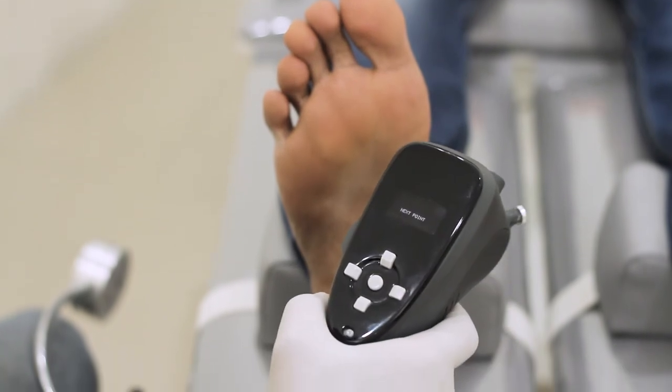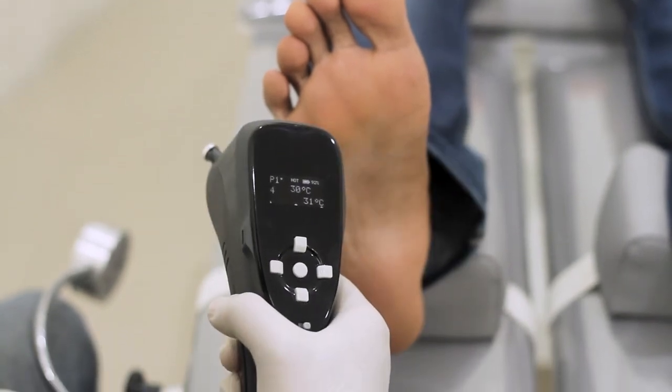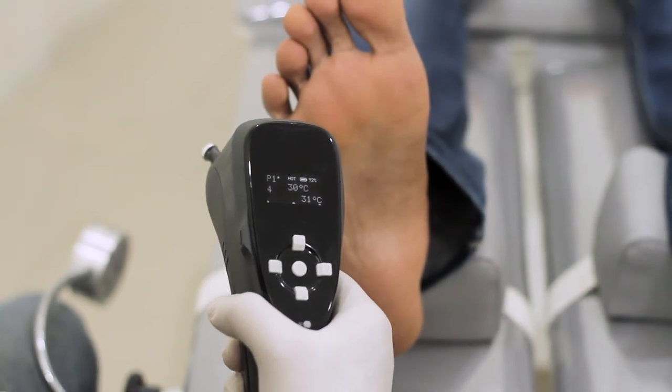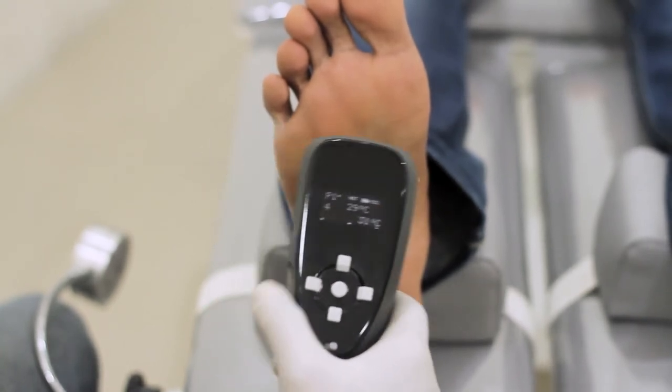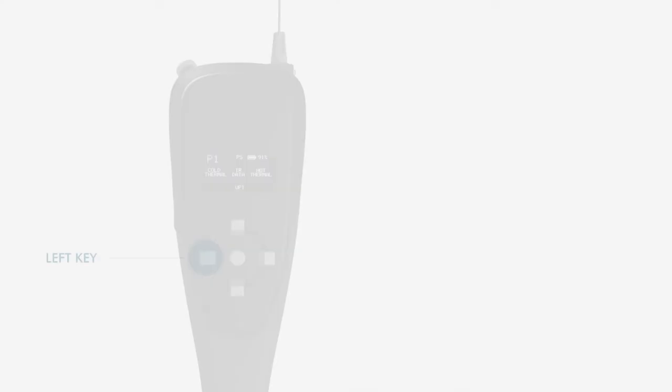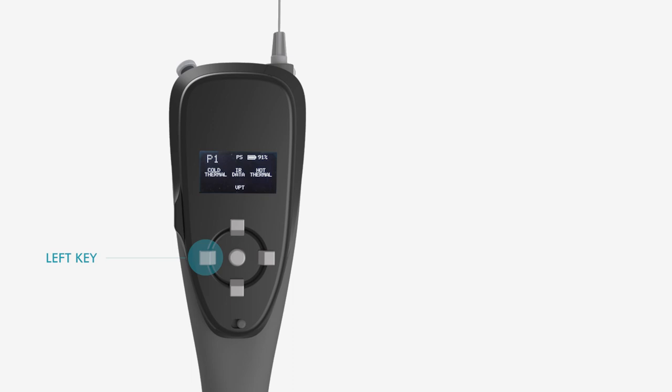Test will move on to the next point after saving the previous data. Please note, the hot probe cannot be set below the ambient temperature. Press left key to redo the test at the same point.